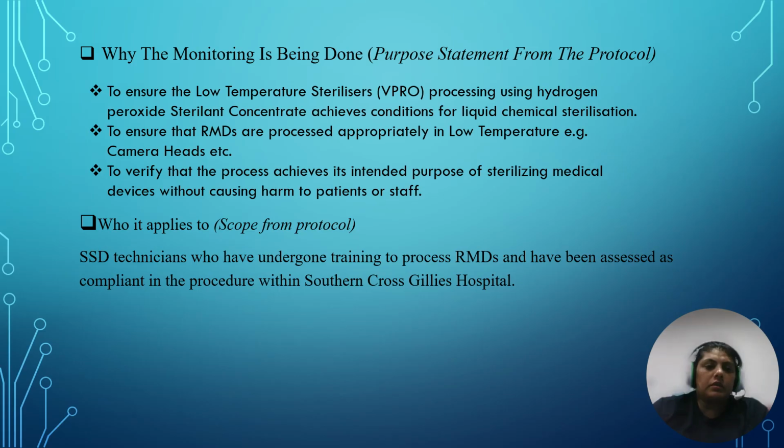Why the monitoring is being done: the purpose is to ensure that the low temperature sterilizer VPRO processing, using hydrogen peroxide sterilant concentrate, achieves conditions for liquid chemical sterilization, to verify that the process achieves its intended purpose of sterilizing medical devices without causing harm to patients or staff.